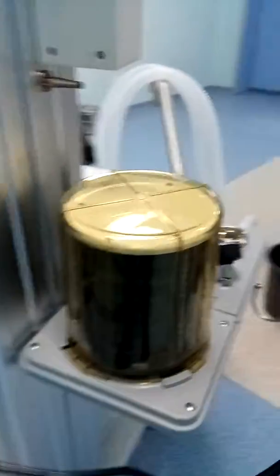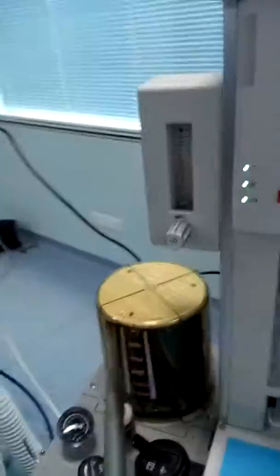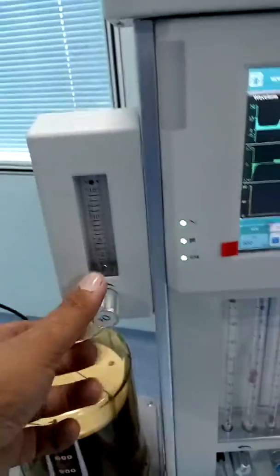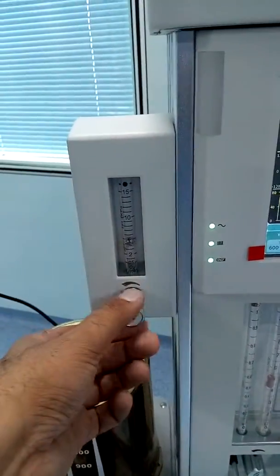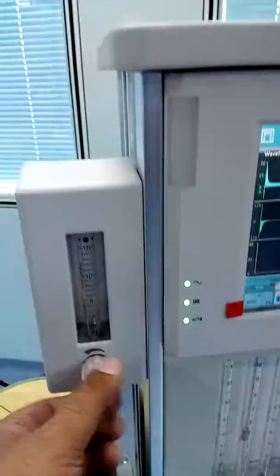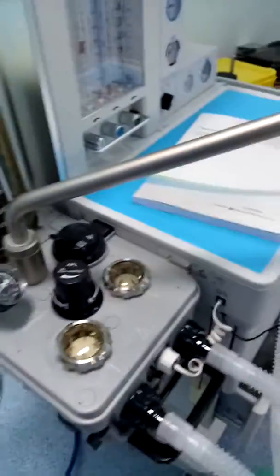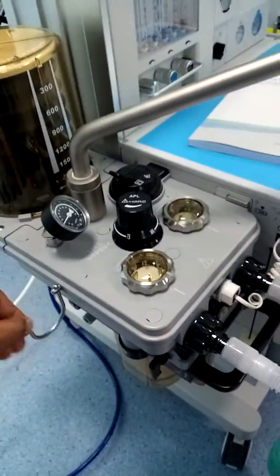Ventilation is ongoing. I'll show you this from the front side. This is the observable flow meter for oxygen, so you can deliver oxygen to the patient. Here is the output — the oxygen output.